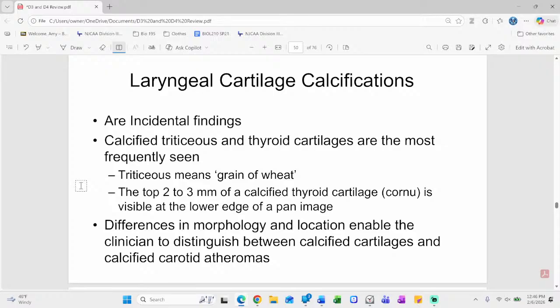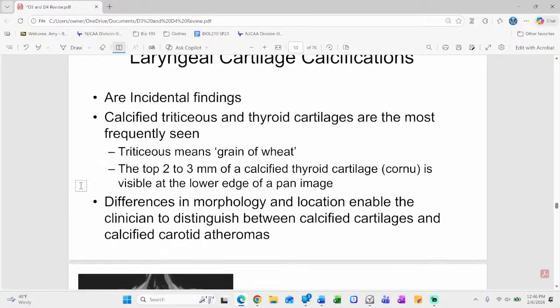That's the take-home message. That's why I hammer this so hard. Those of you going to programs, I know you will get to programs where other residents do not know this. They have not been taught this and how to separate away what is normal thyroid cartilage away from pathology and carotid plaque. And I have our students who then go away and email me back. I was the one who knew what that was, right? Because everybody doesn't teach it. I want you to be armed with as much knowledge as you can about this.